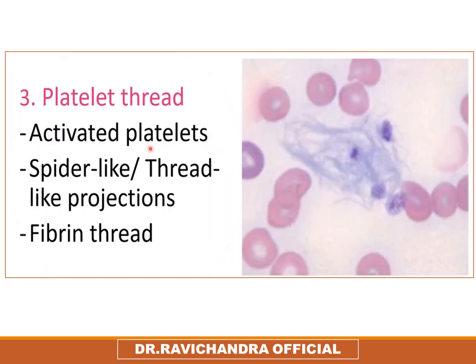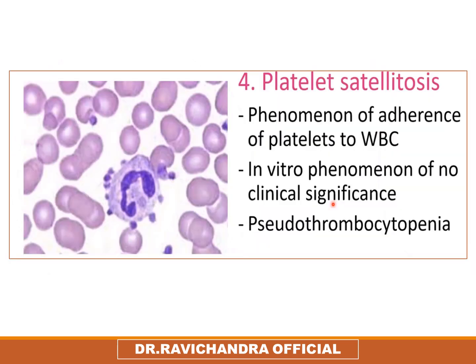Platelet threads are activated platelets, and they will have spider-like or thread-like projections and fibrin threads. Platelet satellitosis is a phenomenon of adherence of the platelets to white blood cells. This is an in vitro phenomenon and it has no clinical significance. Platelet satellitosis is seen in pseudothrombocytopenia.